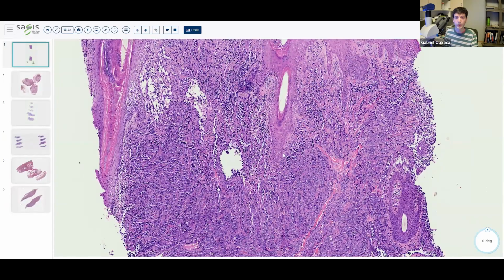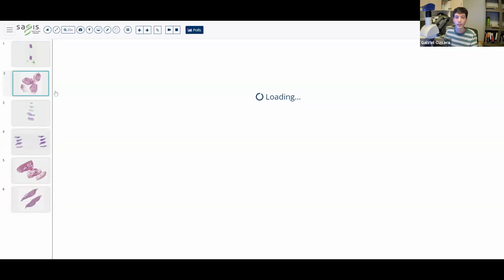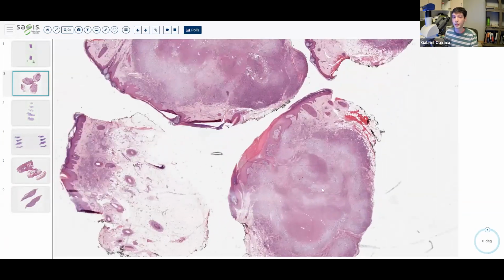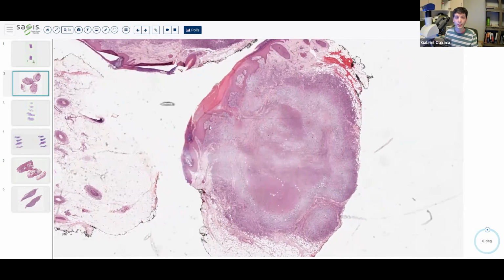So yeah, epithelioid angiosarcoma. Our next case, let's start again at low power. This particular lesion would be seen in someone who's around 20 to 30 years old in distal extremities, commonly hands and fingers. So at low power, we have a nodular dermal-based proliferation, maybe even multinodular, if you consider this to be its own little nodule.